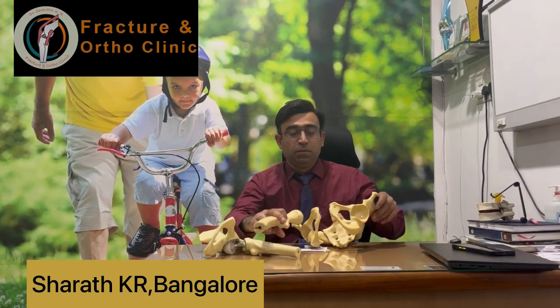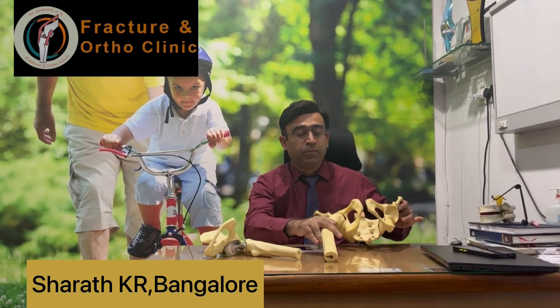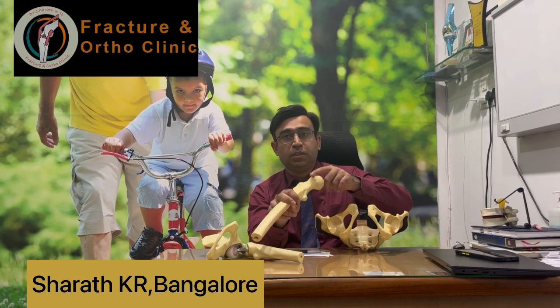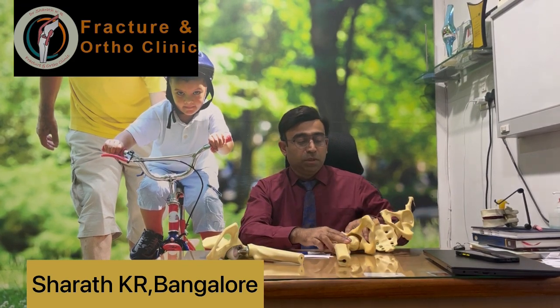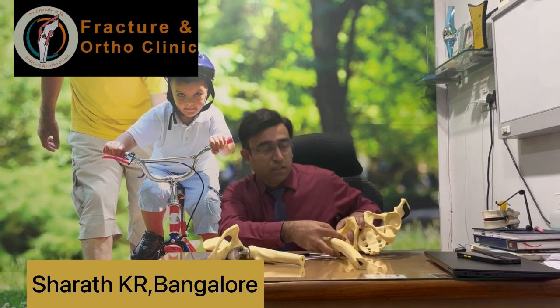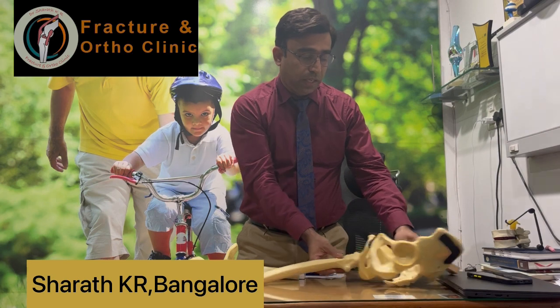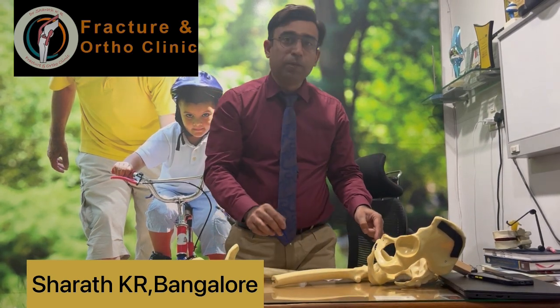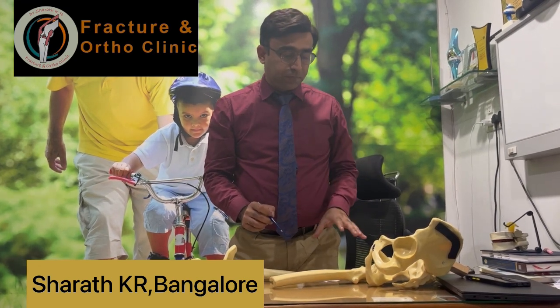This is how the bones are seen if the person is lying down, and this is the hip joint. This is the ball of the femur. This is the socket. If we are seeing directly from the front and operating from the front, this is called direct anterior hip replacement surgery.